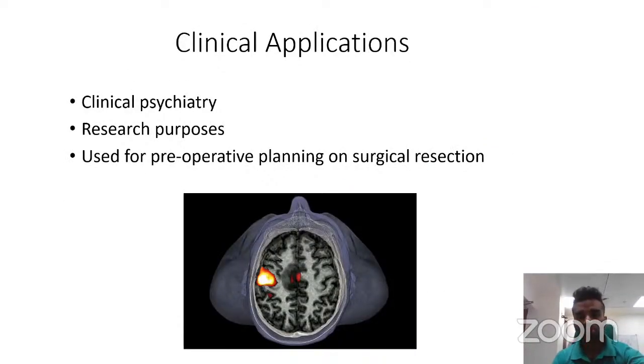so when it comes to clinical applications, so far we have discussed what is fMRI, how do we get fMRI activation, what is the principle behind it, then what are the specific regions in your brain which control different activities we do in day-to-day life. But still, you people would be having the question, why fMRI? What is the use of fMRI? What is the reason behind doing fMRI?